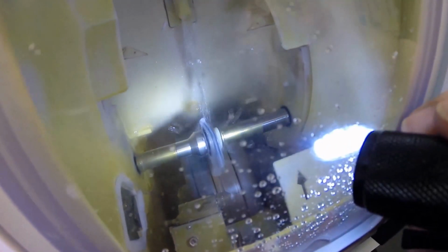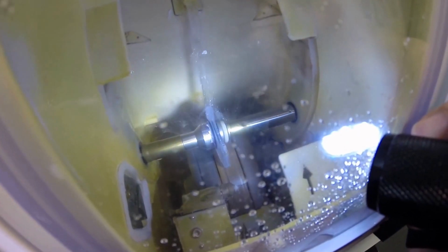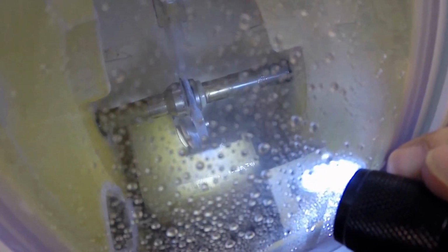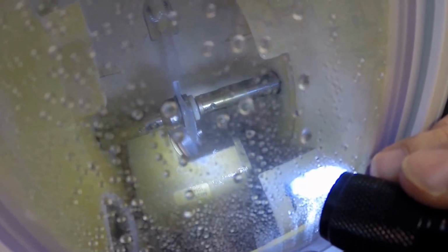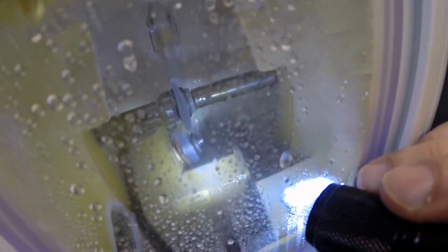So water has begun to kick in and spray on the lens. It does that for the last 20 seconds of the cutting cycle, just to wash away any optical debris, optical sawdust if you will. Now in just a moment, an arm will come out. At the end of that arm is a little spinning wheel, something you would find on a Dremel tool. That's applying the safety bevel to the rear surface, the concave surface of the lens, just to smooth everything out that could be left over from the cutting cycle.